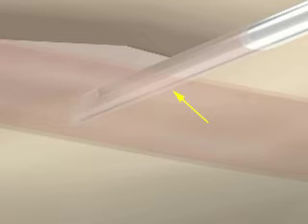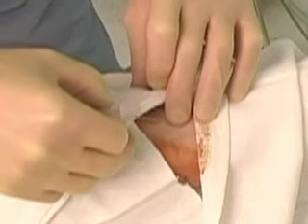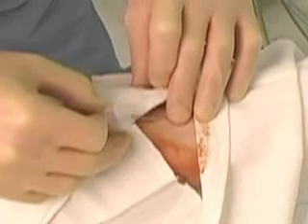allowing for successful cannulation. In some instances, the catheter may get hung up on the skin, making it hard to advance. The risk of this can be minimized at the start of the procedure by making a skin nick using either an 11-blade scalpel or a larger bore needle.